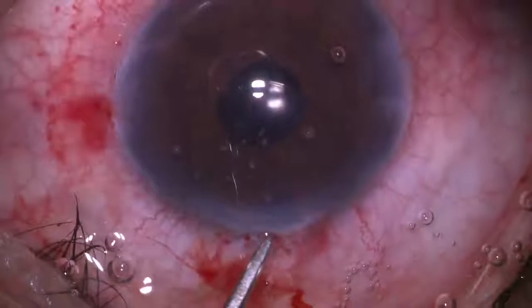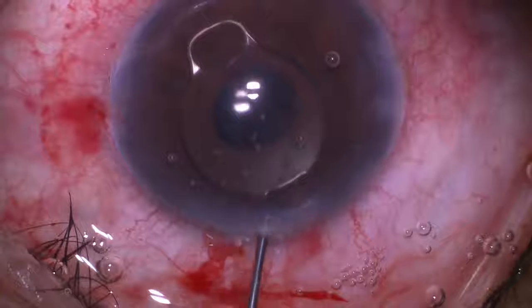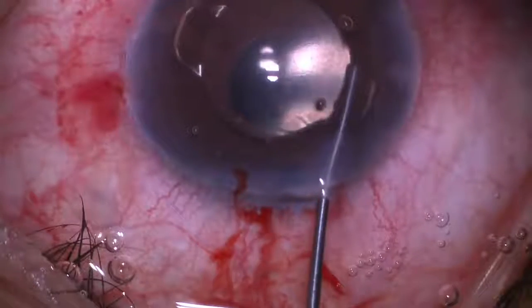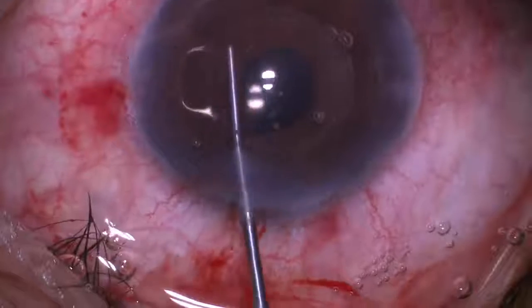IOL was then inserted in anterior chamber. Since it was a vitrectomized eye, a very limited vitrectomy was required.